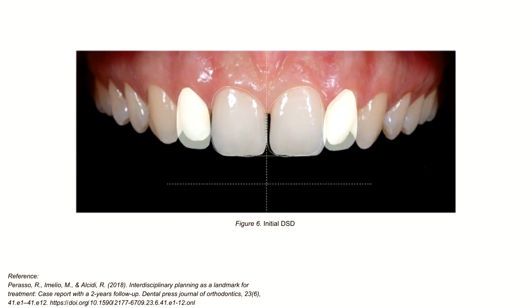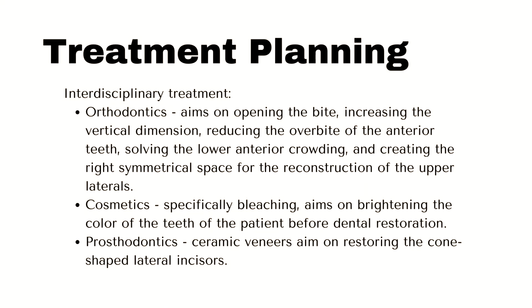This shows the initial digital smile design of the patient. It shows how the maxillary lateral incisors would look with the veneers. The treatment plan for the patient is an interdisciplinary approach involving orthodontics, cosmetics, and prosthodontics.